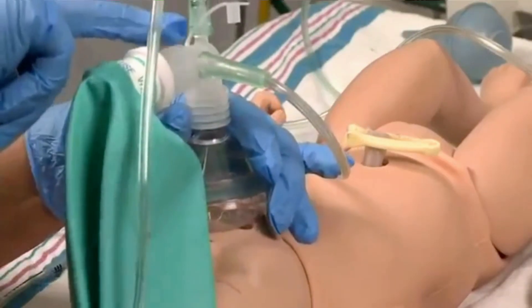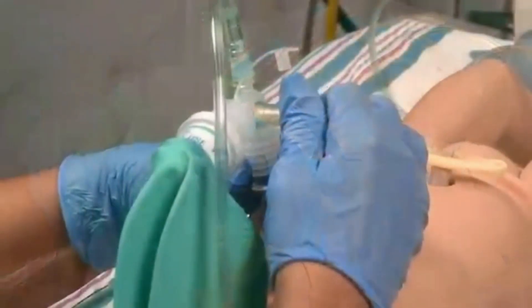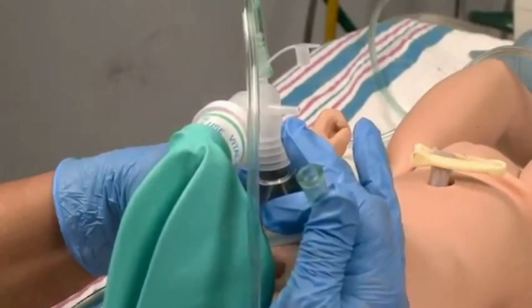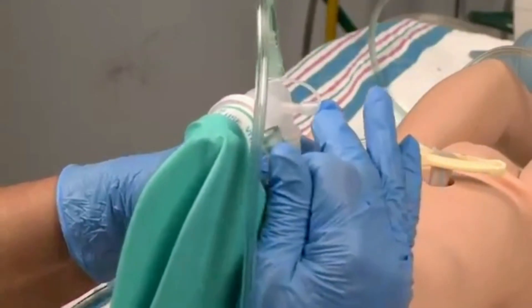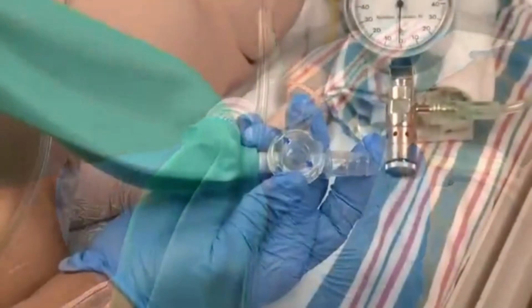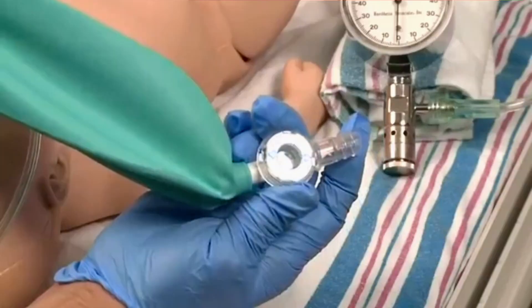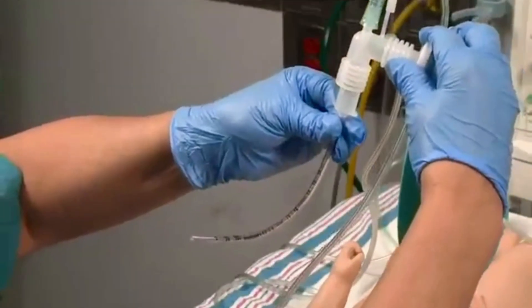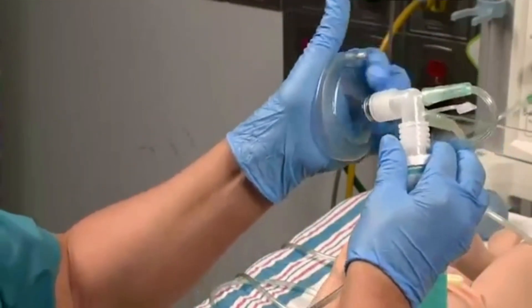If your flow inflating bag has a connecting site for a pressure gauge, a gauge must be attached to the site. If the gauge is absent, the attachment site must be occluded with a plug, or the site will be a source of leak and the bag will not inflate properly. The flow control valve provides an adjustable leak that allows you to regulate the pressure in the bag when connected to an endotracheal tube or when the mask is held tightly on the patient's face.